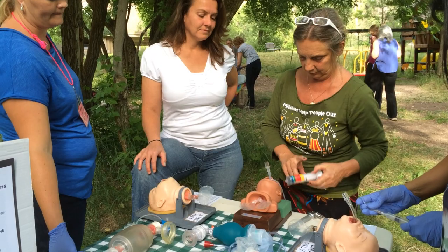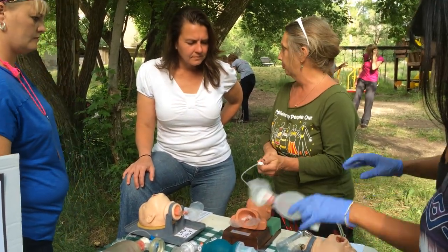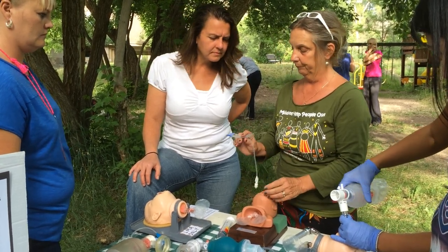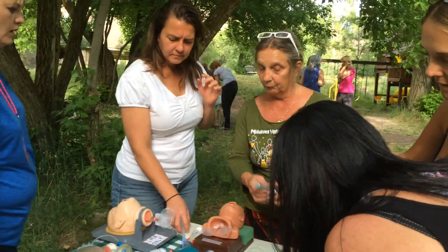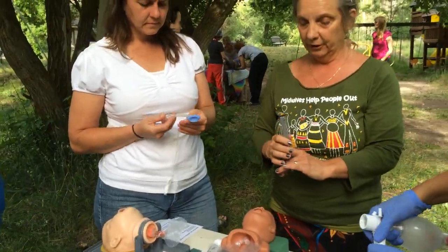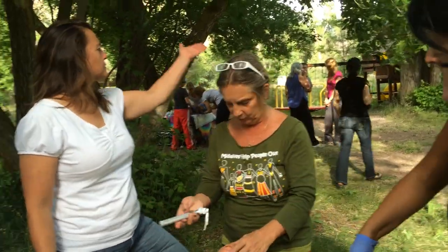Obviously, you have to take all the air out of this once the baby starts breathing on its own and take it out. Can you demonstrate that again? I'm going to go through the whole thing again. I'm just waiting until enough people were here.